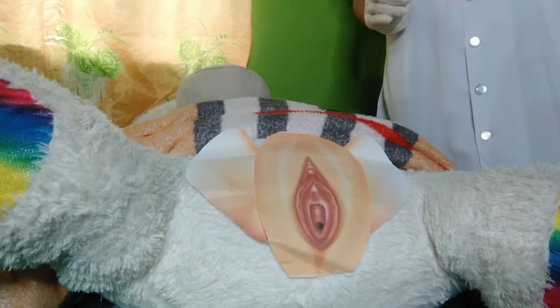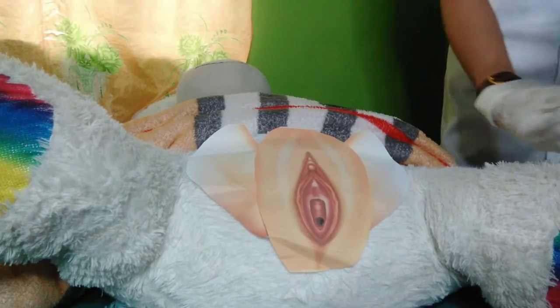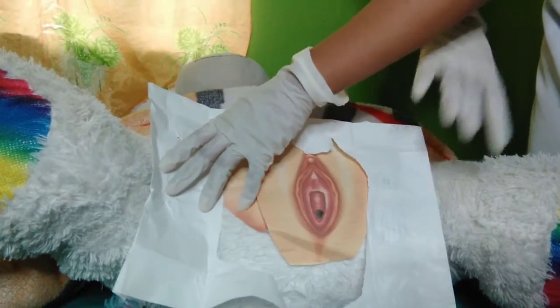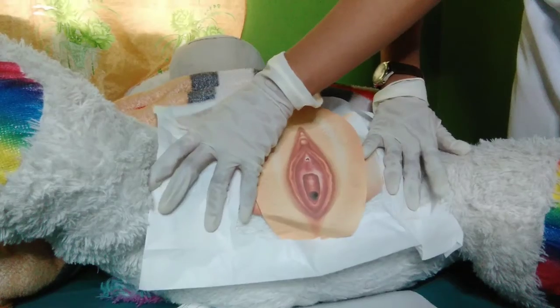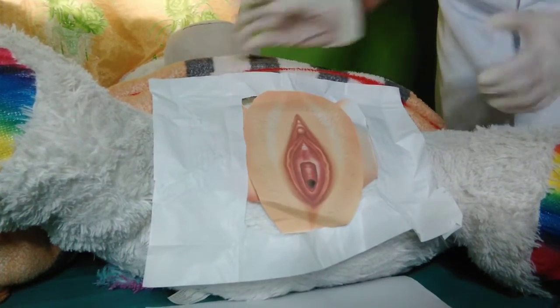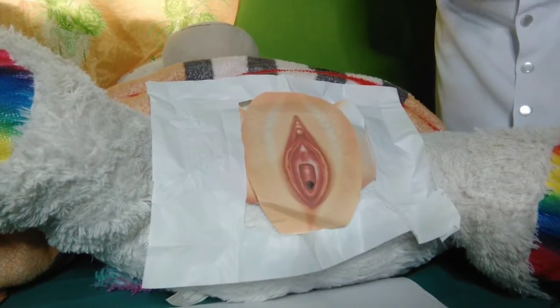So 15 is to drape the patient with the drape found in the catheterization kit, either using sterile gloves or using ungloved hands and only touching the outer edges of the drape. Ensure that any sterile supplies touch only the middle of the sterile drape, not the edges, and that sterile gloves do not touch non-sterile surfaces.